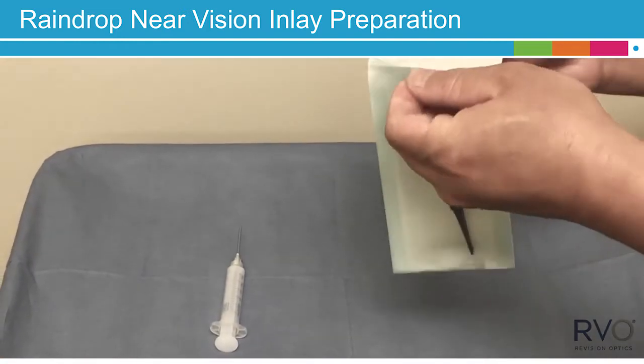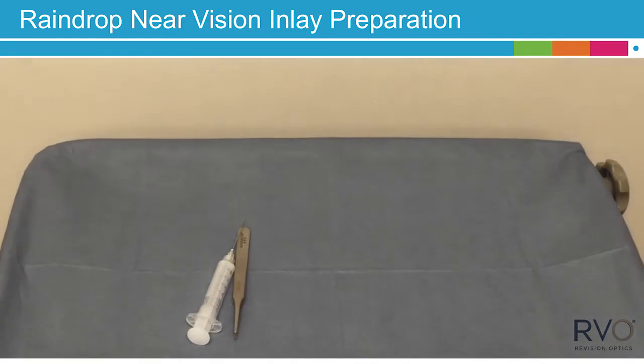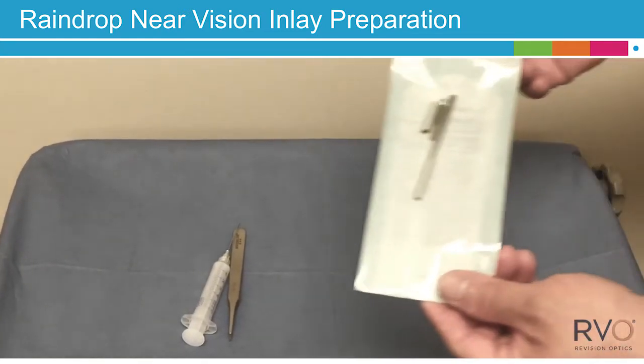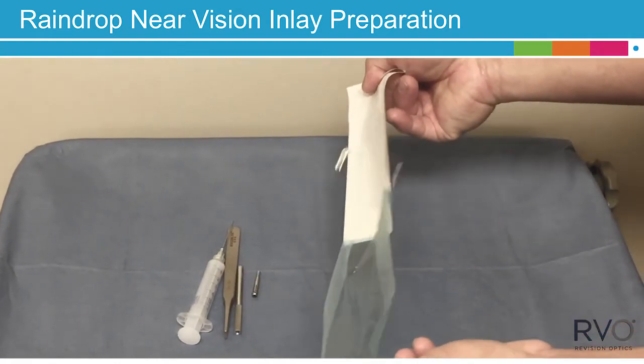Then peel open a sterile package containing a pair of tweezers and transfer that to the sterile field. Open a sterile package containing the sterilized Inserter Chuck Handle and transfer that to the sterile field.